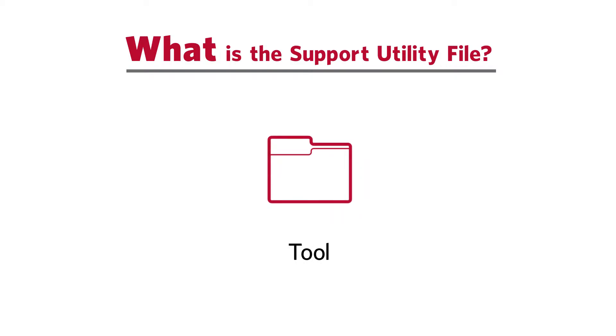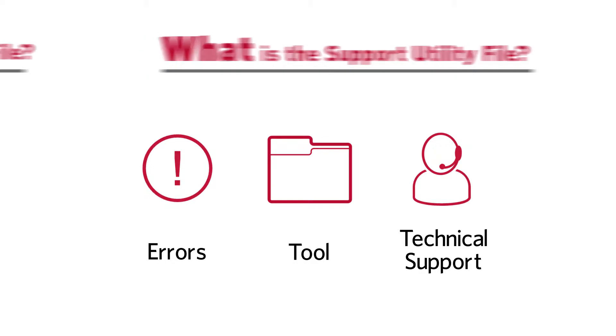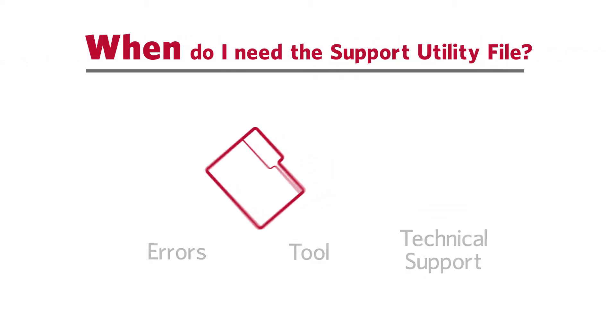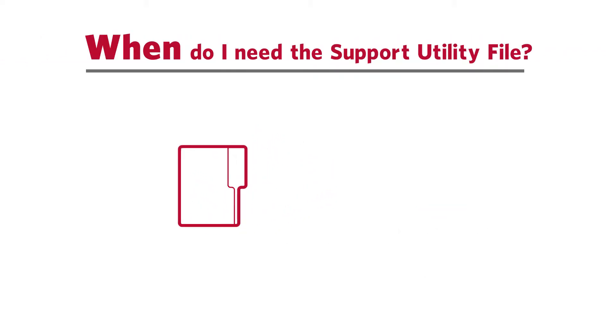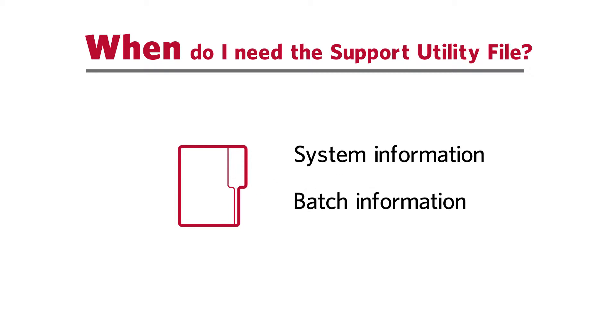The support utility file is a tool Luminex Technical Support can use to help troubleshoot instrument errors. The support utility file will include information specific to your Luminex instrument, as well as the option to include batch information.